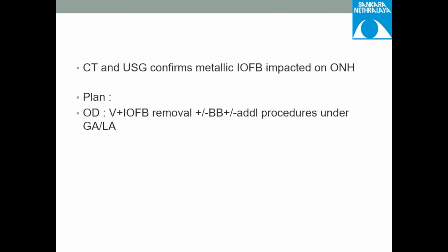In this case, CT was also done. I'm sorry, I don't have the plates, but it confirmed that there was a metallic foreign body on the optic nerve head. So vitrectomy and IOFB removal was planned along with a belt buckle.